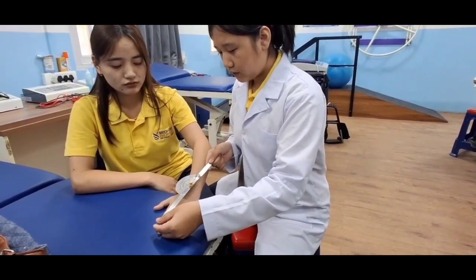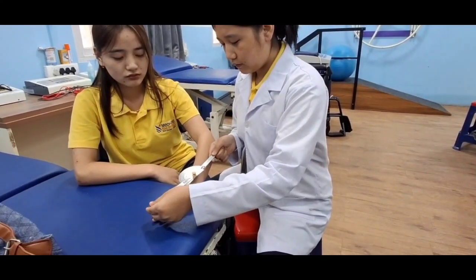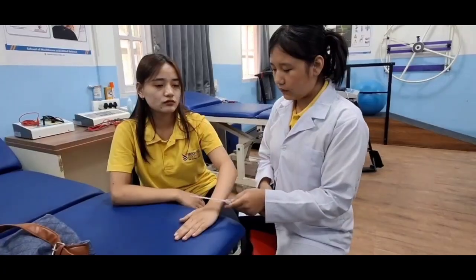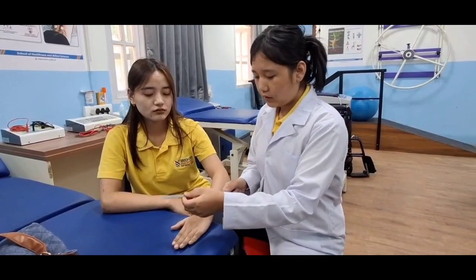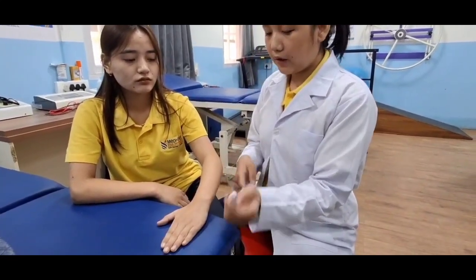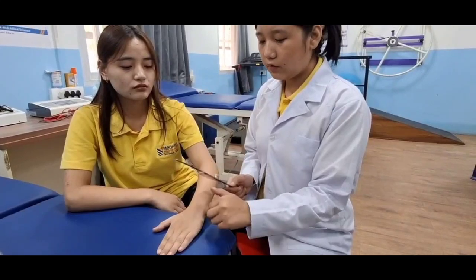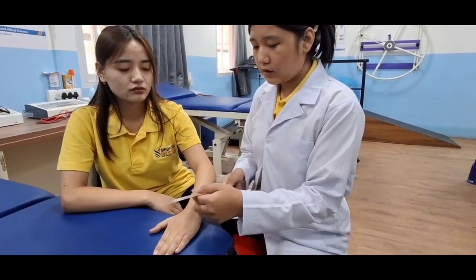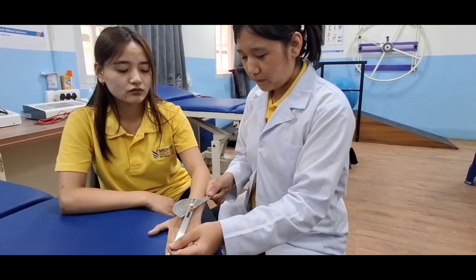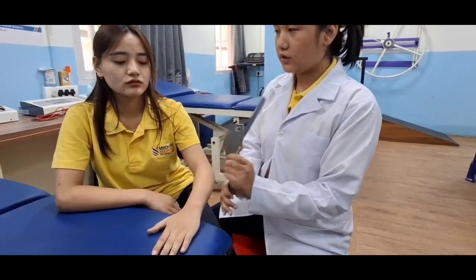Radial. Okay. Her range of motion is 20. Its normal range for radial is 20. Let's check ulnar deviation. For ulnar, we have to use the same procedure as we used for radial deviation. Okay, 30. This is the normal range. Thank you.